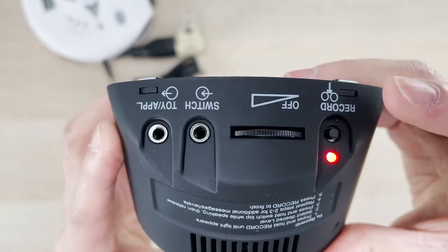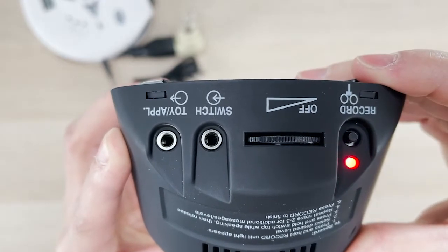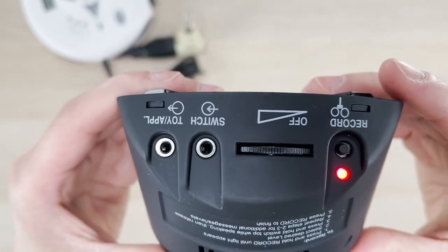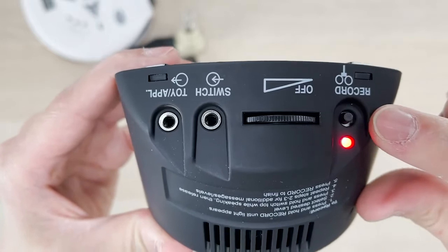Turn on light. Once you finish recording, you can press the recording button to exit the recording mode.